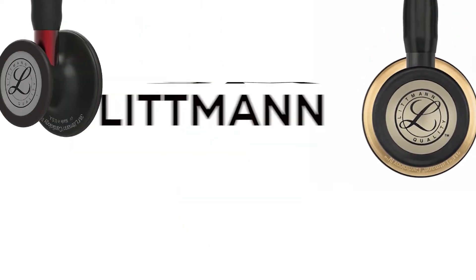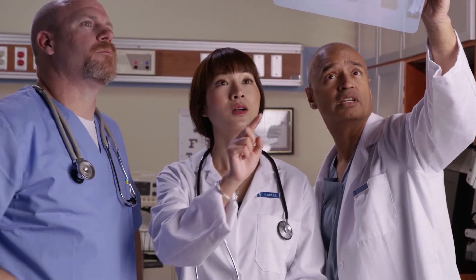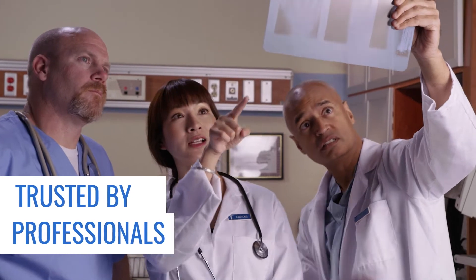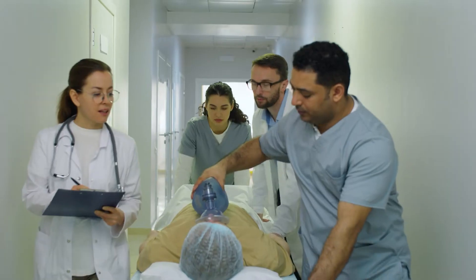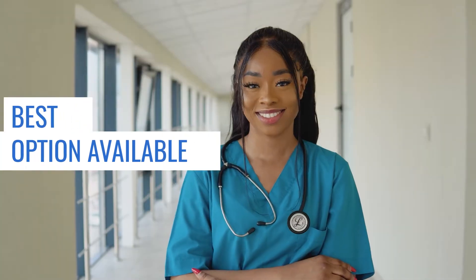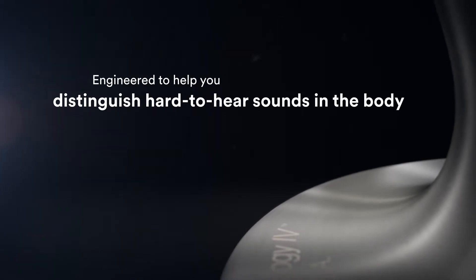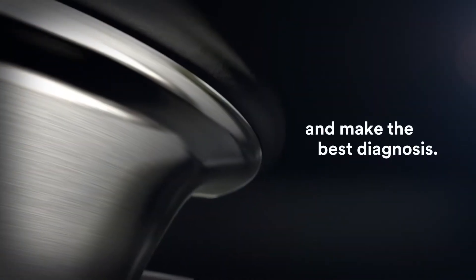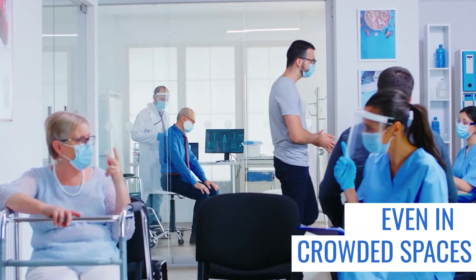First, the 3M Littmann Cardiology IV Diagnostic Stethoscope. Among the current favourites of medical practitioners and students in Littmann's line of stethoscopes is the 3M Littmann Cardiology IV. If you plan to work in the ER, cardiology, or critical care field, this is probably one of the best options for you. The device is designed so you can hear very subtle changes in a patient's cardiovascular system even when the environment is full of noise and distractions.